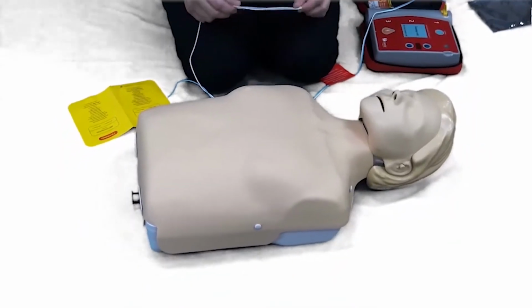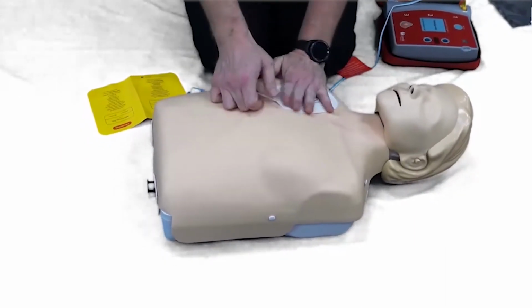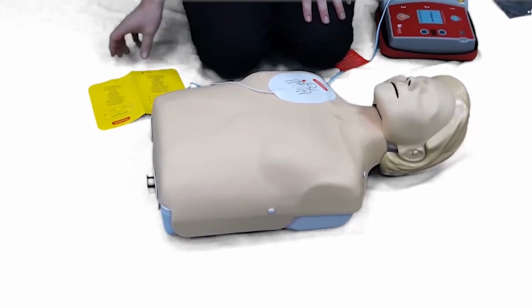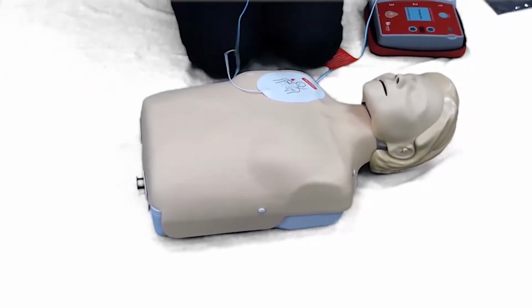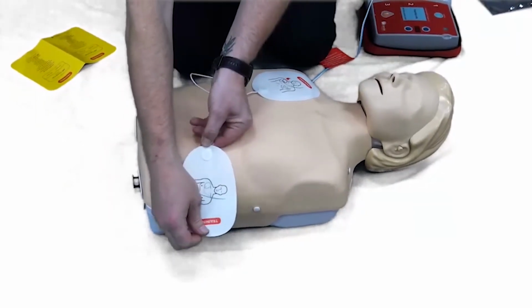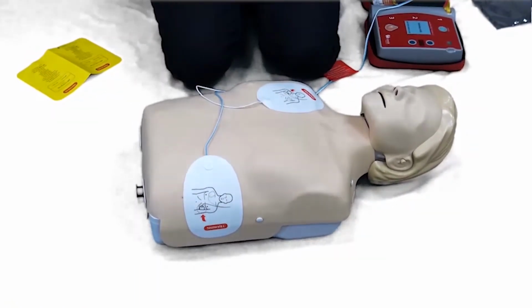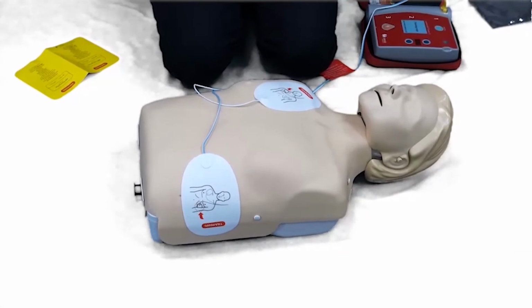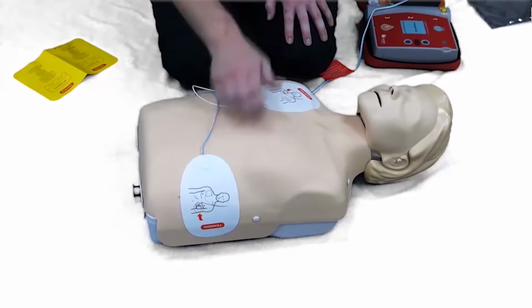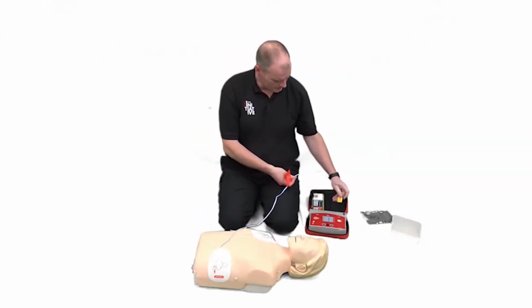We're going to place the first pad on the upper right hand side of the chest, roughly in line with the collarbone as it shows on the picture. Make sure there's a nice firm seal and that there's nothing interrupting that patch sticking to the skin. The second pad we're going to put around the left hand side of the body, around about the bottom of the rib cage, going around onto the side slightly. Again, making sure that there's nothing that's going to interfere with that pad sticking. We've also got to make sure that there's a clear line of conduction, i.e. that there's nothing going to interrupt the cycle of conduction between those 2 pads. So now I'm going to take the connector and plug that in.